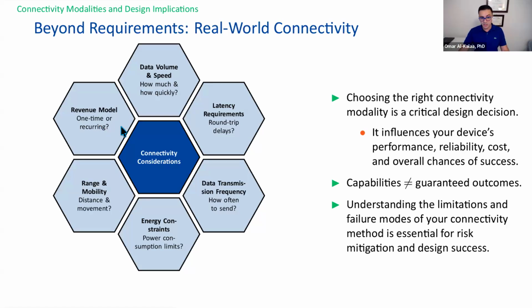And then a very important point that is often overlooked is, what is the revenue model for my medical device, specifically when it comes to connectivity? Is the device being sold as a one-time expense, or is there subscription expenses that will be ongoing? Because if you're looking, for example, at cellular connectivity, basically you should ask yourself the question, who's paying the bill? Just like we pay the bill to everybody's phone monthly.